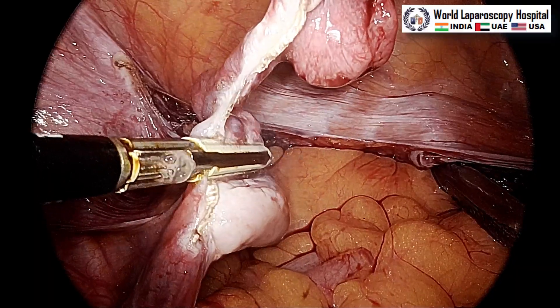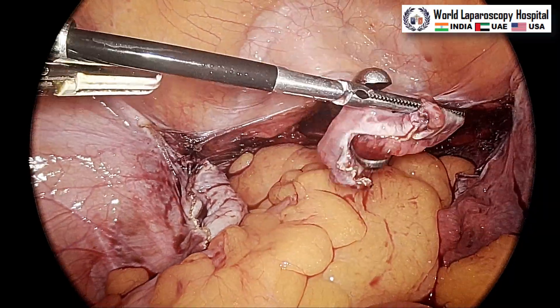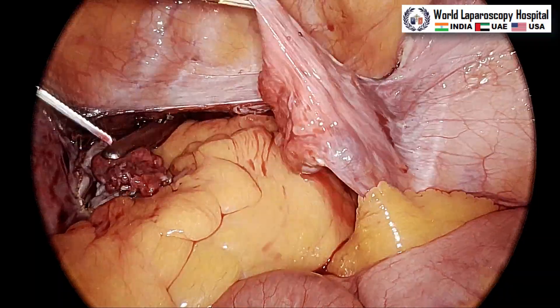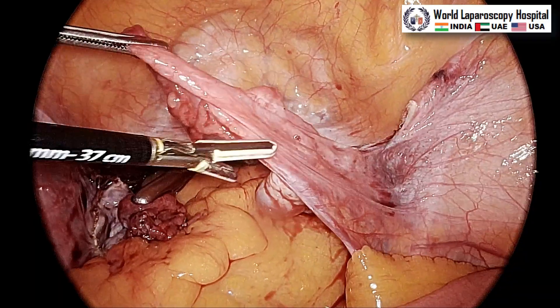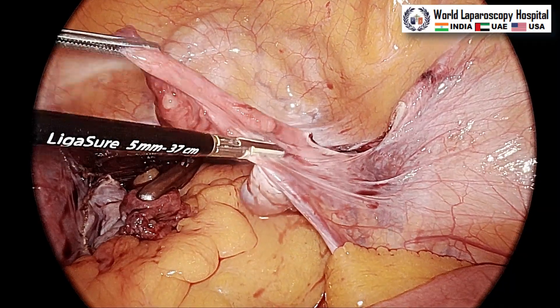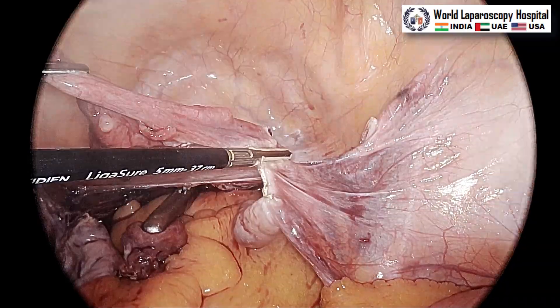A stone-holding forcep, also called a spoon forcep, is introduced through the vagina and the assistant catches the tube. The left tube is done. Now for the right tube, anteromedial traction is given again — you catch it with the utero-ovarian ligament and within one or two catches you can take the tube. Take care not to go very near the ovary or the infundibulopelvic ligament to prevent devascularization of the ovary.